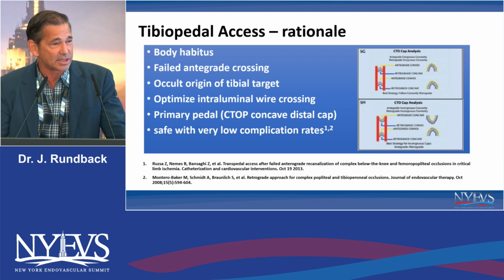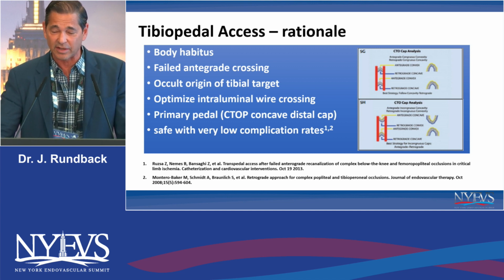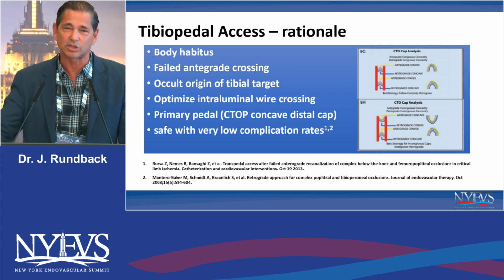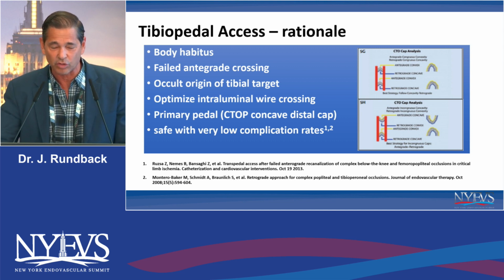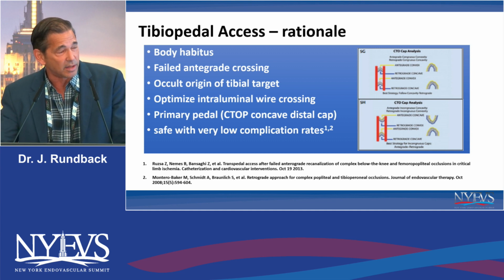Certainly body habitus is a problem, although we did talk about doing direct SFA access if you're going antegrade. Sometimes you can't cross antegrade in this CTOP classification, which Dr. Mustafa and Dr. Saab, who you saw earlier, helped develop, gives you guidelines as to whether you'll be able to cross antegrade or retrograde based upon the convexity or concavity of that antegrade or retrograde cap, as you see on the right.